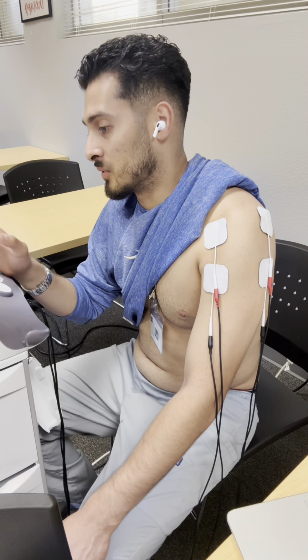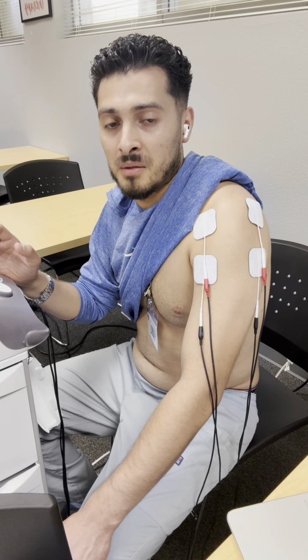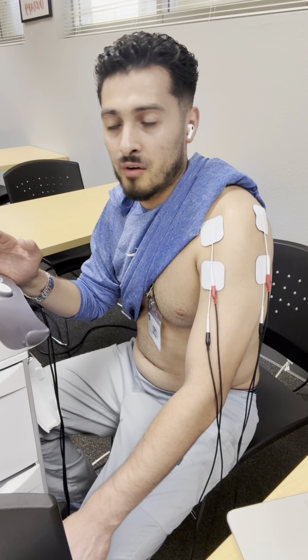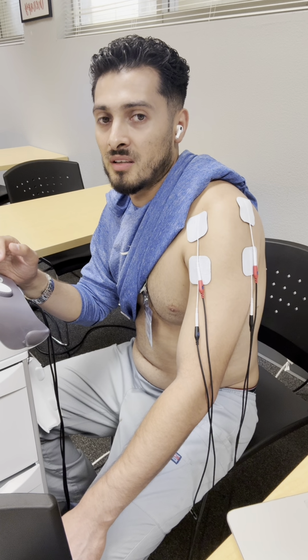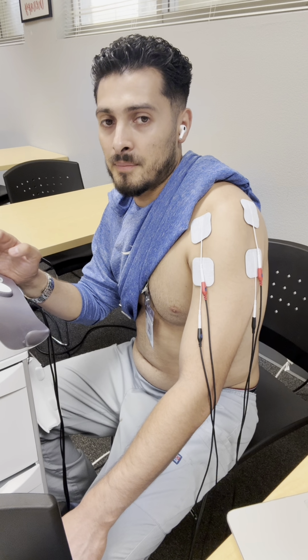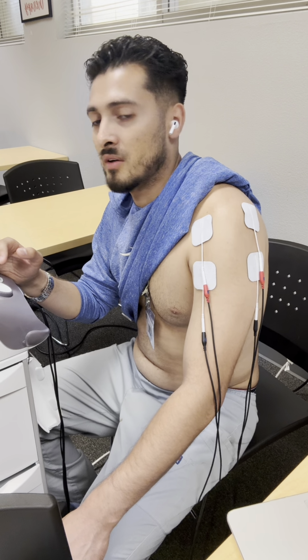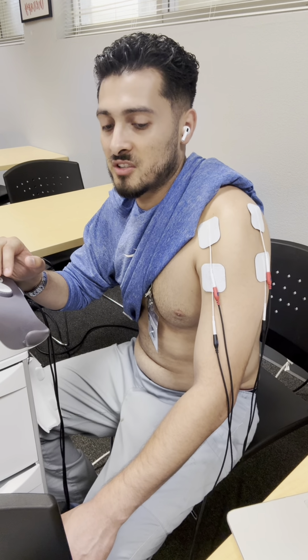I'm just messing around with the intensity here. For me, I kind of like the blend of both because the tingling, buzzing is comfortable, but I also want those contractions to stimulate, increase that blood flow to the area and get more circulation going. It's gonna help with flushing out anything that needs to get flushed out of there.